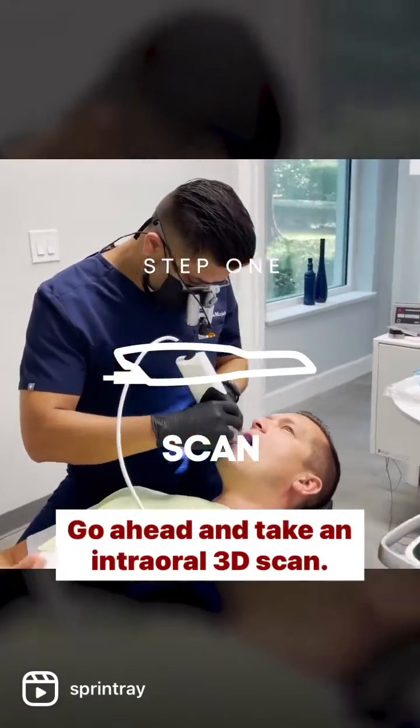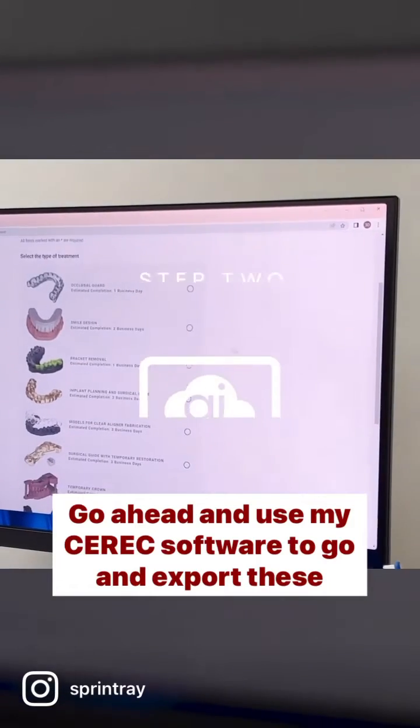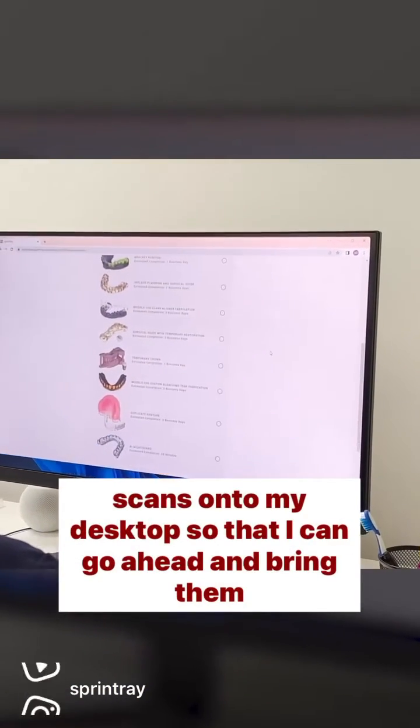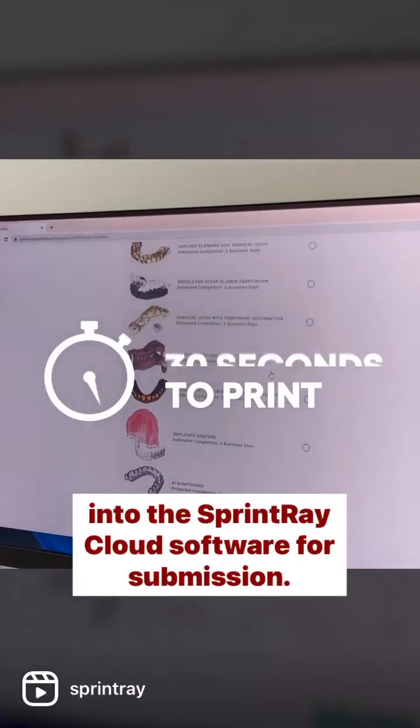Go ahead and take an intraoral 3D scan, then use CEREC software to export these scans onto my desktop so that I can bring them into the SprintRay Cloud software for submission.